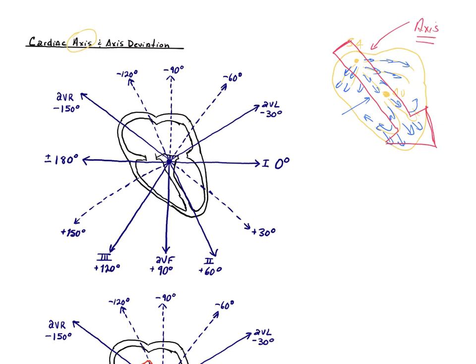Okay, cool. So what we've done, and this is completely arbitrary, we could have done this very differently, but this is just how the pioneers of this did it, and this is what stuck. What we've done is we have made a circle around the heart. So I want you to imagine that there's a circle, and that's this drawing right here. So make a circle around the heart.